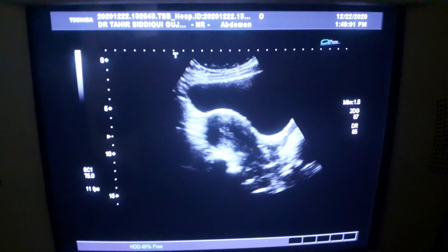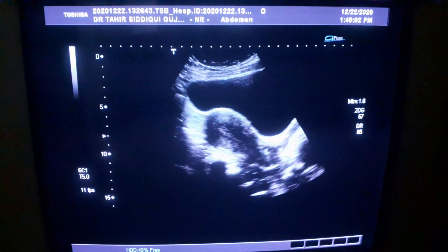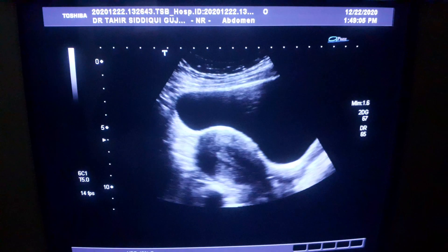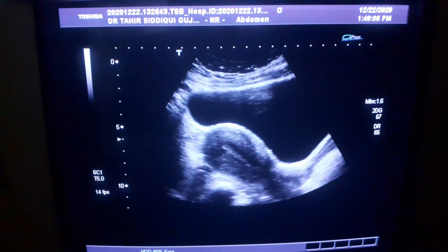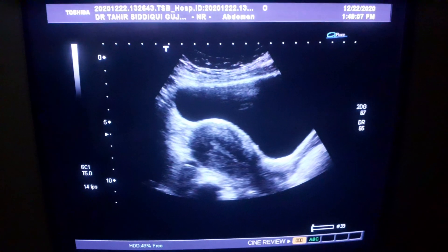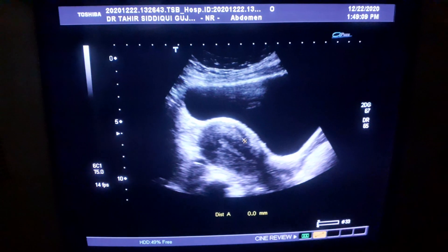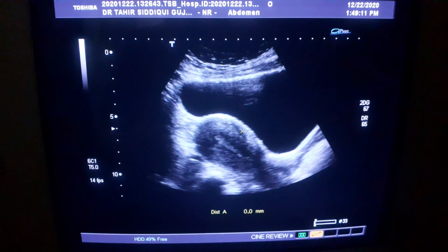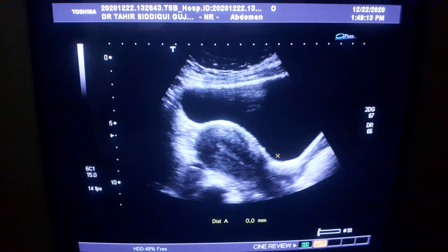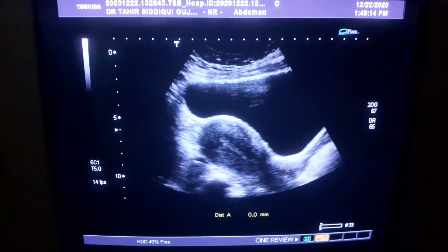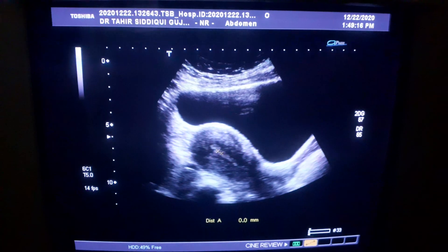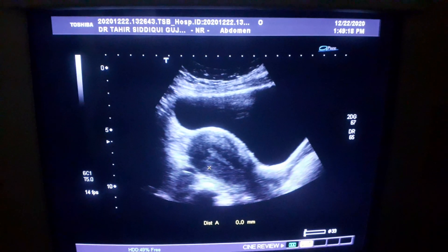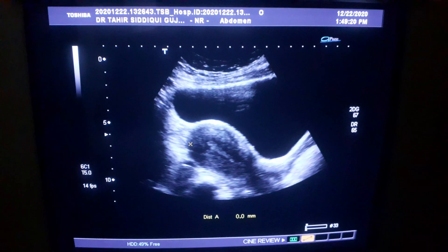Longitudinal section of the uterus — this is the anterior myometrium, outer wall is normal, regular cervix, endometrial canal is normal, posterior myometrium is okay.